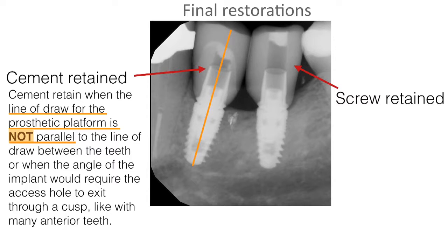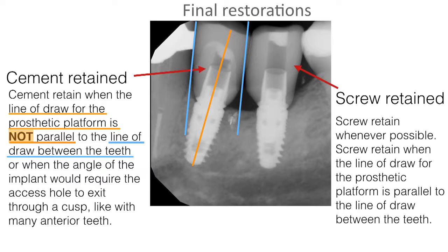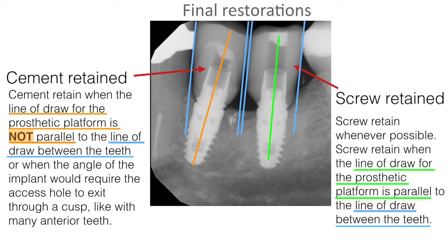what you're dealing with is the line of draw for the platform. If it's not in parallel, the line of draw between the teeth, if it's off angled like that, that's when you know you need a cement. If you can get it the other way around, where the line of draw is parallel to the adjacent teeth, then you can screw retain. And that's really the gist of when to screw retain and when you need a cement retain. So if you follow that in making your decisions restoratively, you'll know when it's best to screw retain.